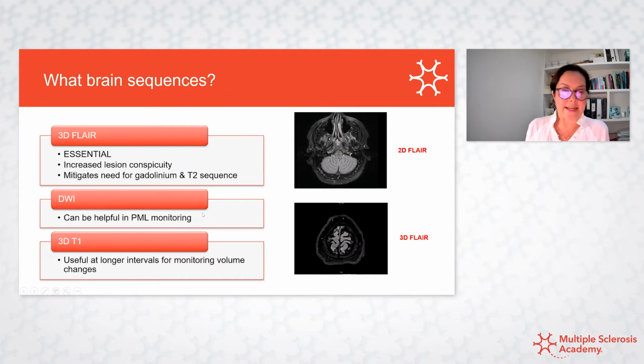It's not very helpful in MS or aging lesions. It's not very reliable in aging MS lesions, but it can be helpful in PML monitoring.